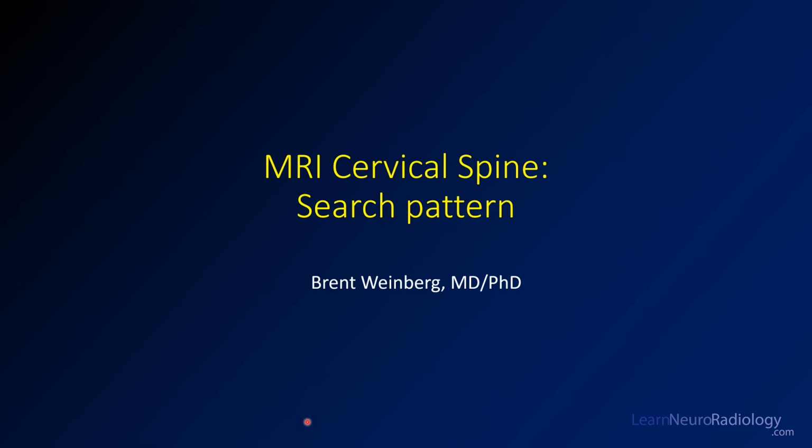Today we're going to talk about a topic that people have asked to see. They want to see how they should approach an MRI of the cervical spine and what a search pattern for that might be. So we're going to spend some time talking about that today.